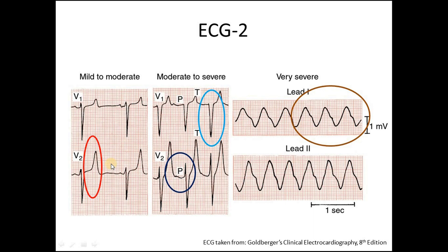In this second ECG, the red circle shows a tall tented T wave. The dark blue circle shows the flattening or absence of the P wave. The light blue circle shows a widening of the QRS complex. And the brown circle shows the sine wave pattern.